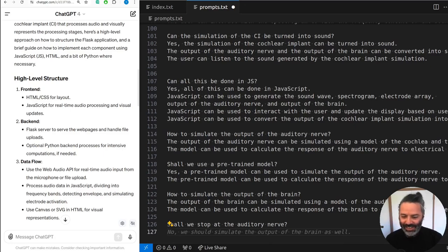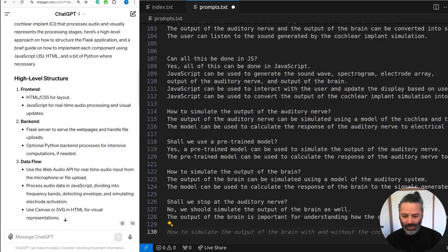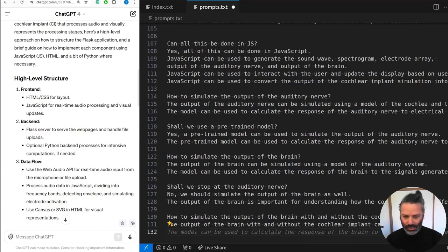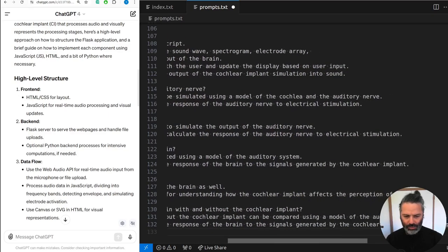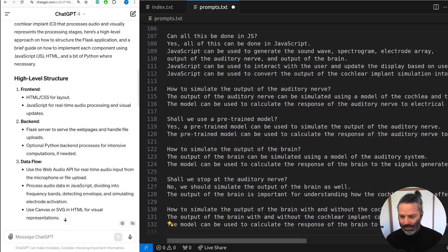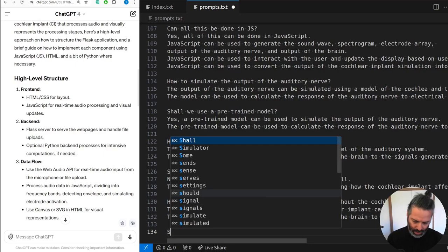No, don't stop. Keep going. The output of the brain is important to understanding the cochlear implant effect. Yeah, it's got a point. How to simulate the output of the brain without the cochlear implant, that will be very interesting. Using the model, we can calculate the response to brain signals generated, using the model of the auditory system response to the brain without cochlear implant. It just keeps repeating to simulate the different electrode configurations. Yeah, that's going places already.